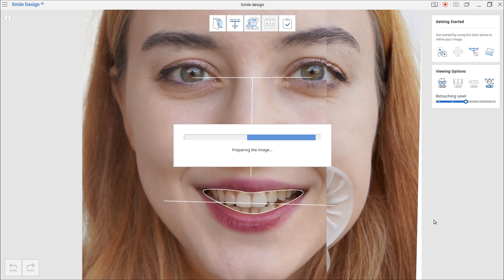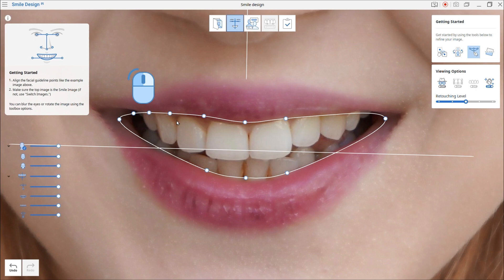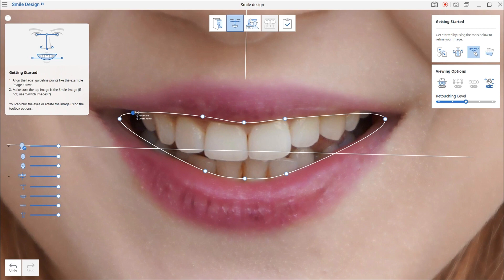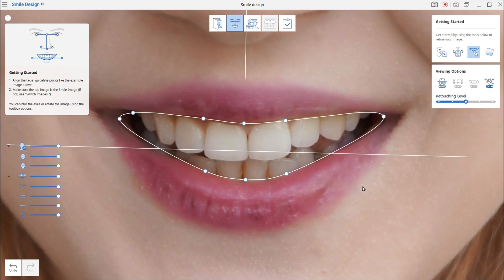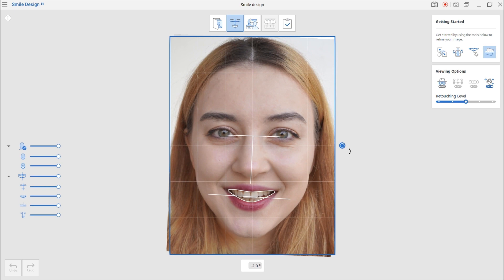You can edit the assigned lip line — left-click to add a point and right-click to delete a point. Next is the Rotate feature. Use this to rotate the image in the range of minus 3 to plus 3 degrees using the Rotate icon, or manually enter the number below.